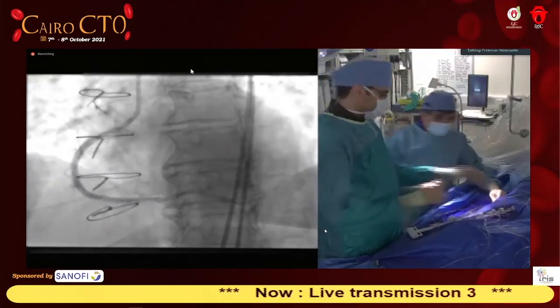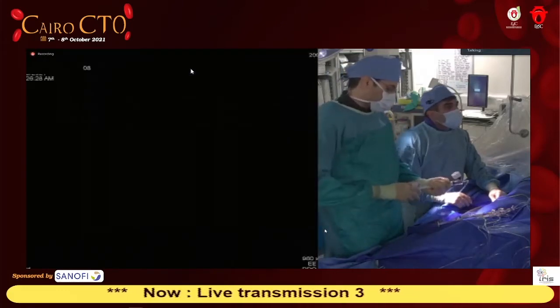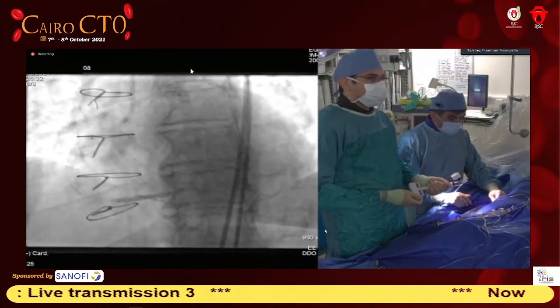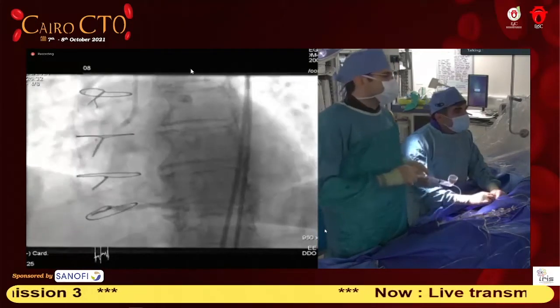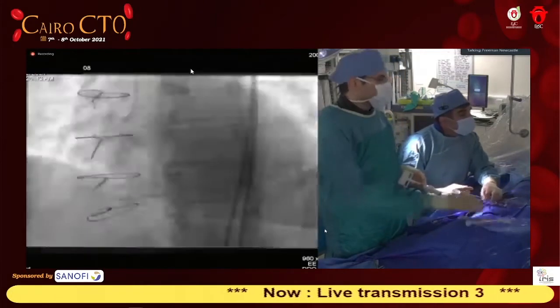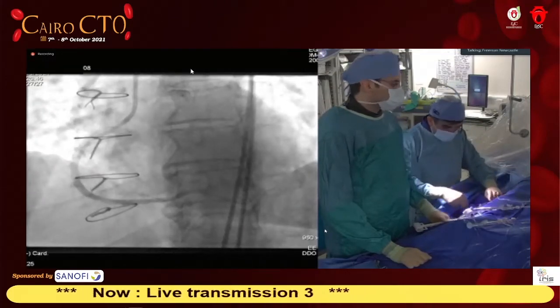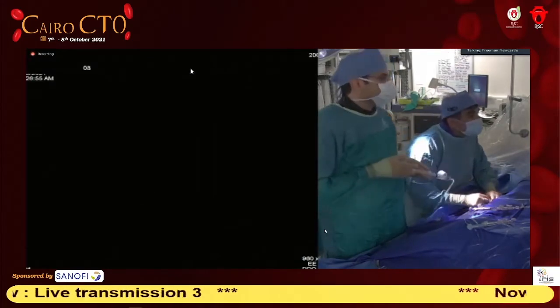Yeah, okay. Go up there. 8, 10, 12. Store. And down. Let's bring it back a bit. Let's just see. So 12 atmospheres should give us enough. 3 or 3.2, and then we'll. Okay, good. Store that. So just a little test. I know the balloon unfolded. We're still there, but okay.